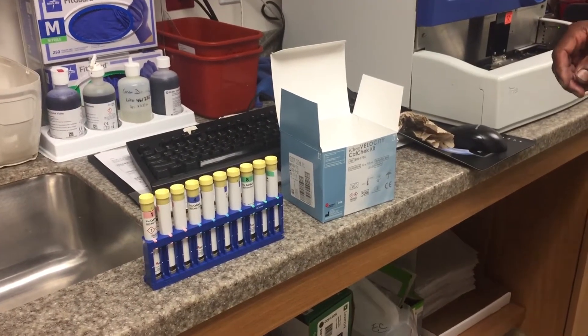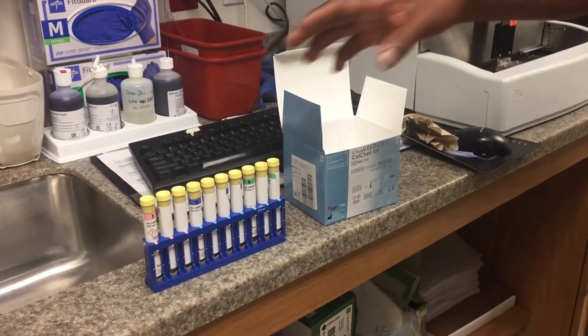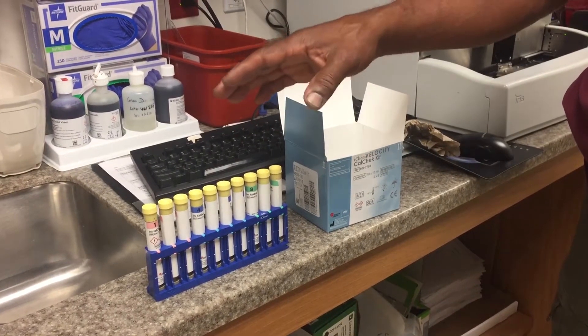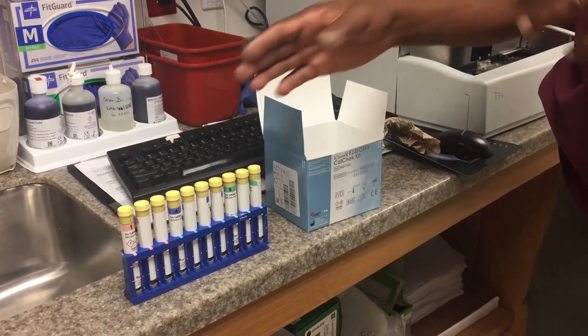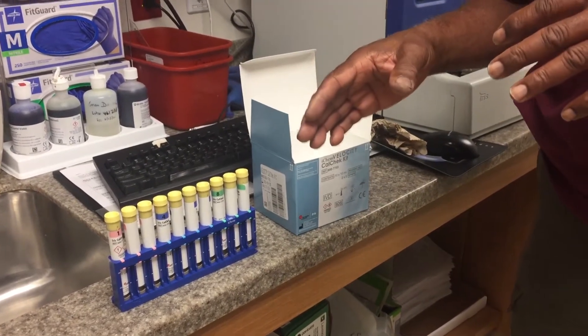Are you going to be taking the caps off all of them? You're going to take the caps off, but we want to put them in order because we want to put the caps on the right one. We don't want to contaminate the samples.